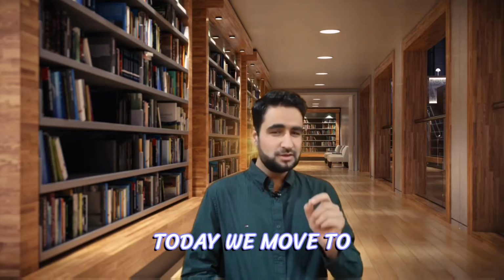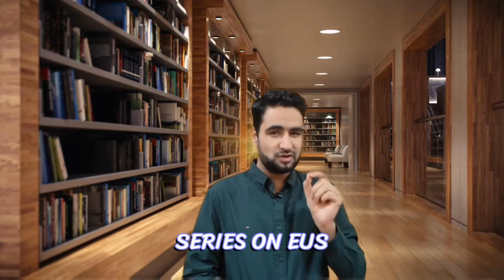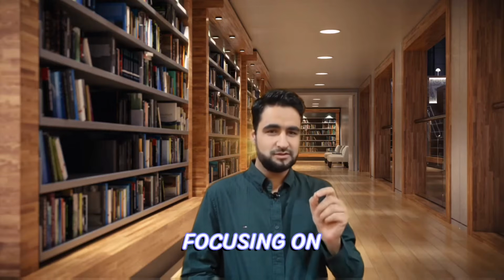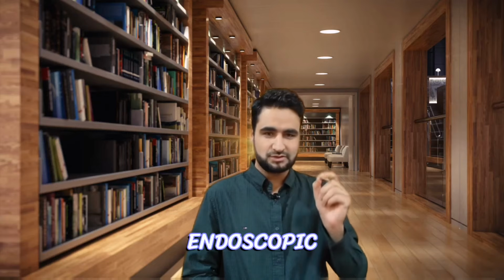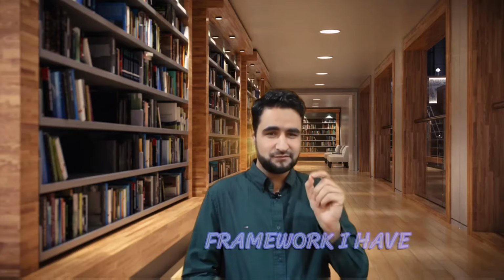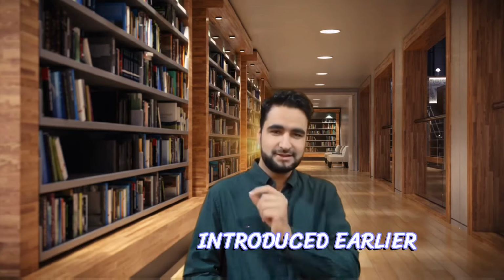Today, we move to lesson 3 in our series on EUS approaches, where we will be focusing on transduodenal bulb approach in diagnostic endoscopic ultrasound. Before we begin, let me briefly revisit an important framework I have introduced earlier.